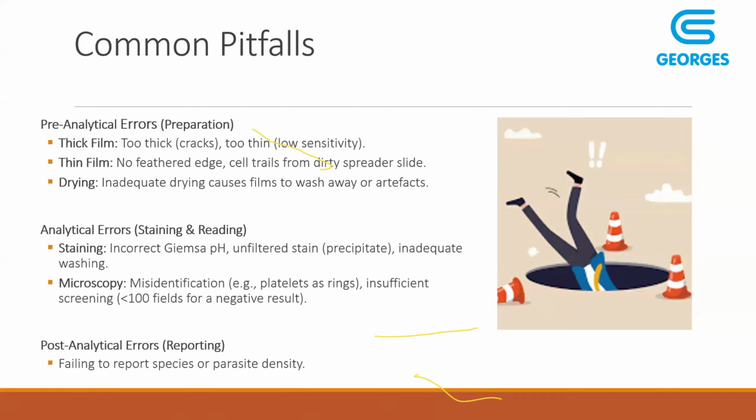And remember, an RDT can detect positive for malaria even after the patient has undergone treatment. A patient might have undergone treatment for around 2, 3, or 4 days, and then when you review a slide, there is no parasite because the parasites are cleared or are so low that they cannot be seen in a slide. But since an RDT is highly sensitive, it will detect it as positive. So it is okay to report as RDT positive and microscopy negative.